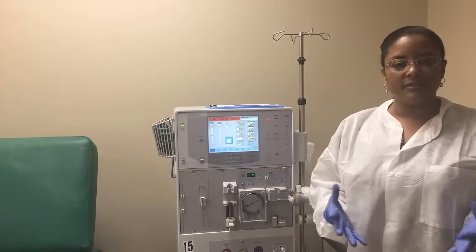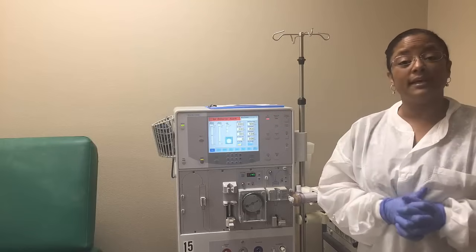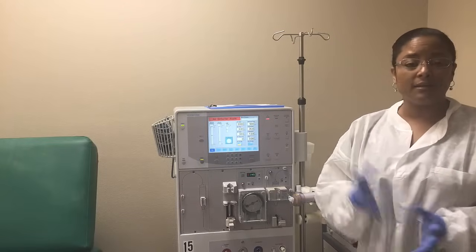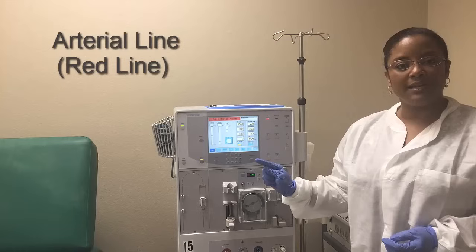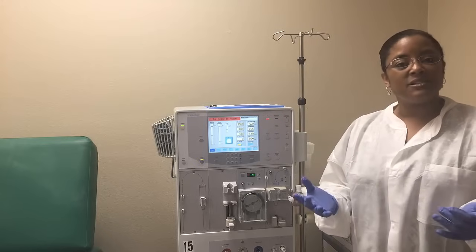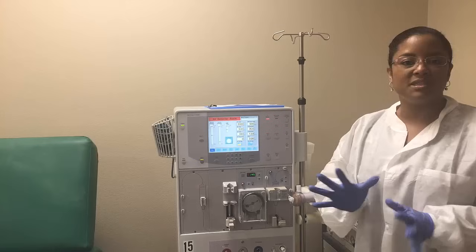Now that I'm properly gowned and have my gloves on, at this point I really don't need a face shield unless there's a policy in your unit that states you have to wear one. For the purposes of this training I am not going to wear a face shield, and I am going to start setting up the arterial line, then the venous line, and then the saline line. Depending on where you work you may see this in a different order, but the end result is going to be the same.